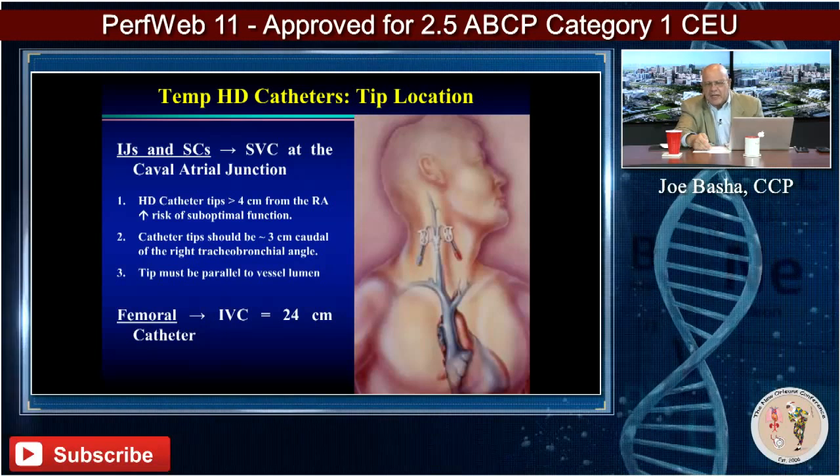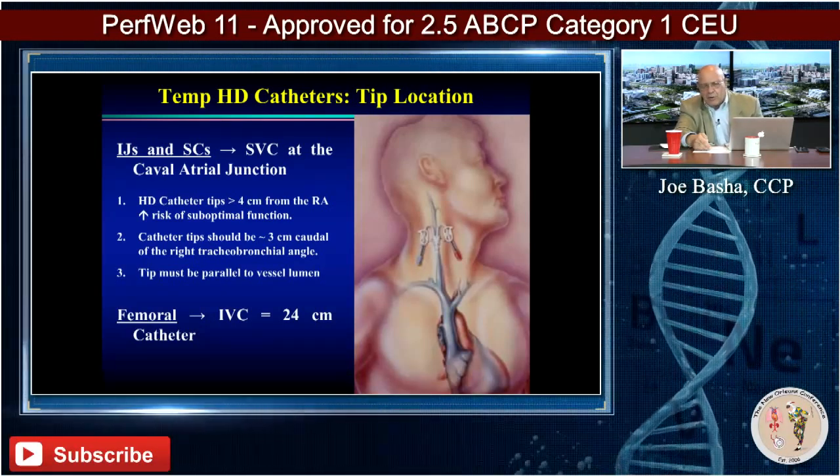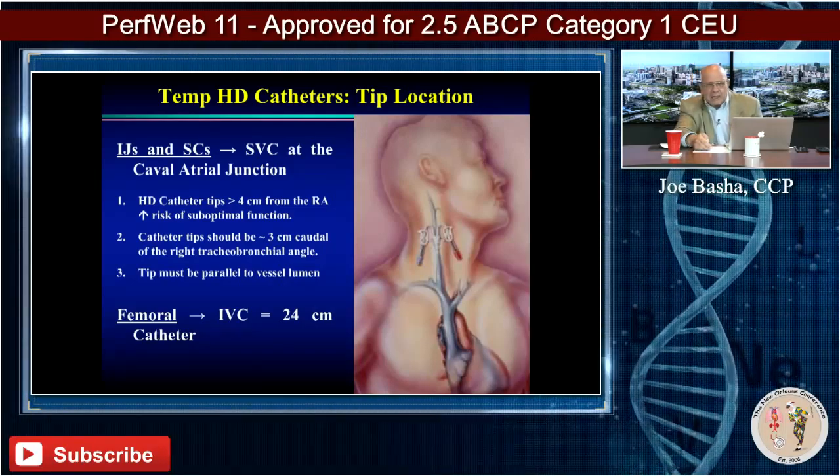If you're using the femoral catheter, you need to use the long one. But no one likes putting anything in the groin, okay? I mean, it's got infection problems. You can't bend the patient. They tend to get kinked. But sometimes that's where they put them, and they go in there frequently.